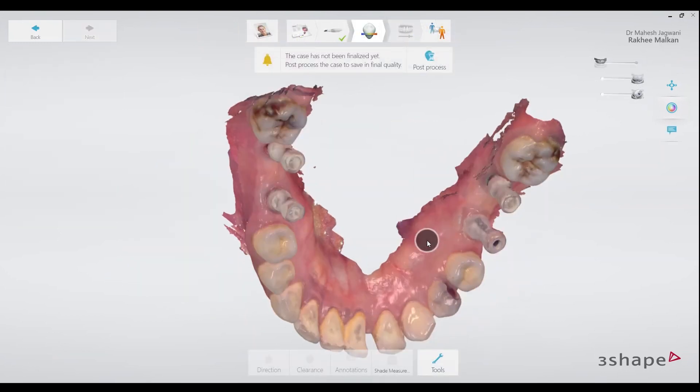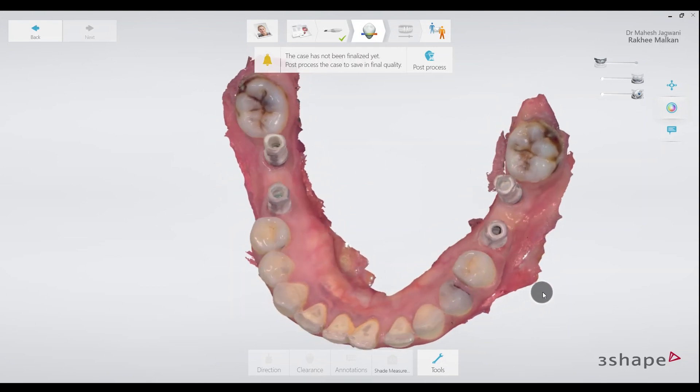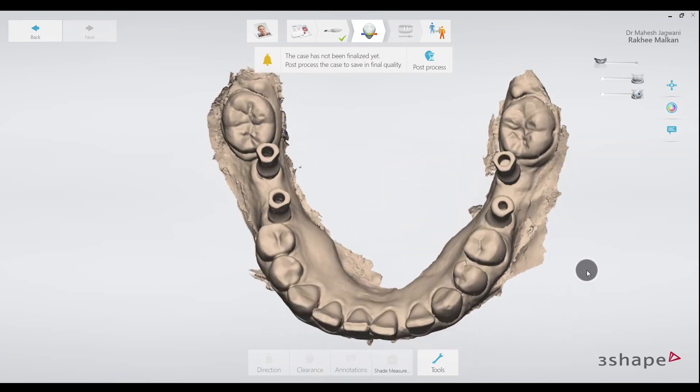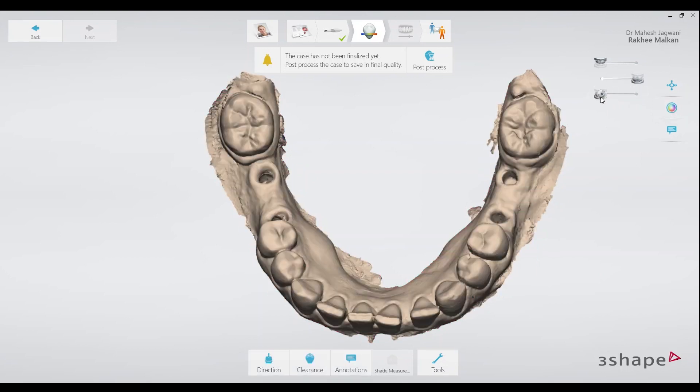This completes my clinical workflow and this is what I am going to send to the lab. It's very important to have good definition on the scan bodies, which can be checked easily on the STL file. You can see that the flat surfaces on the scan bodies have been scanned clearly, since the technician will use them to align the virtual scan bodies on the CAD software.